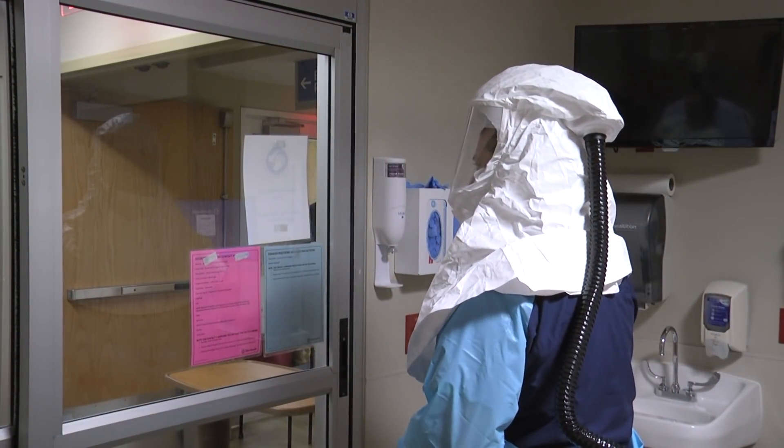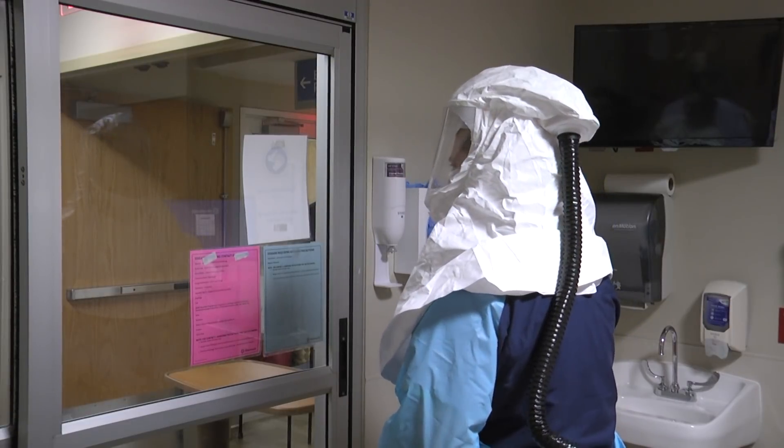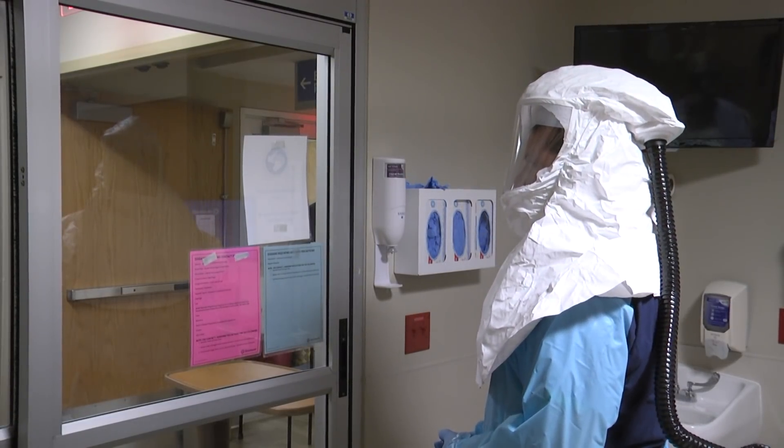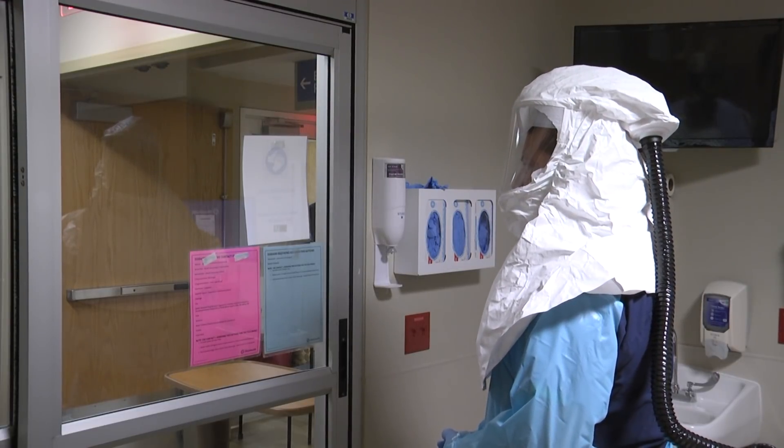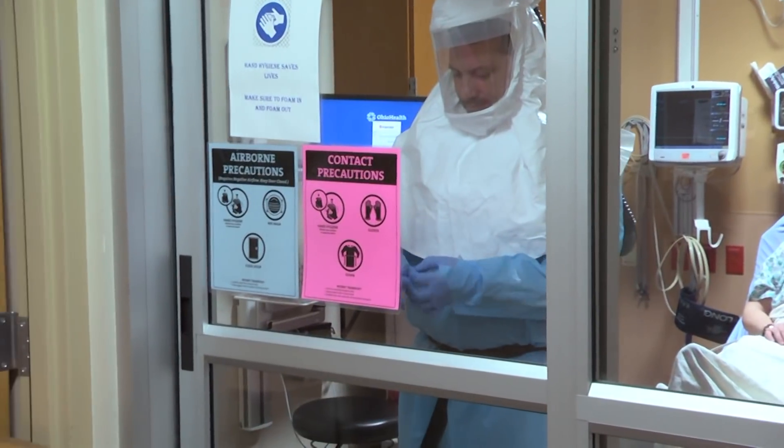Enter the room and close the door. When you're ready to leave the room, remember that the front of your equipment is considered dirty while the back is clean. Do not touch the front of your gown, face shield, or PAPR hood. Remove gloves and clean hands.